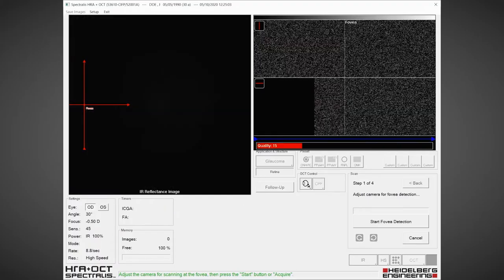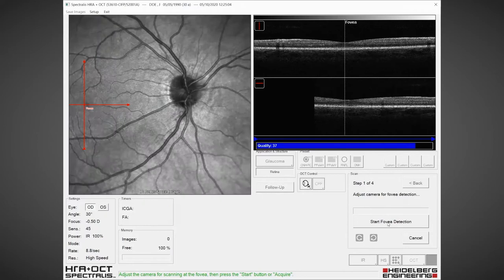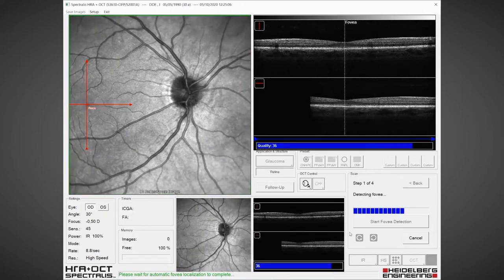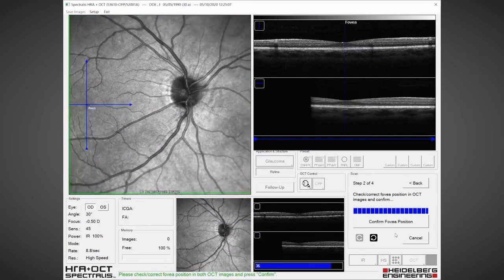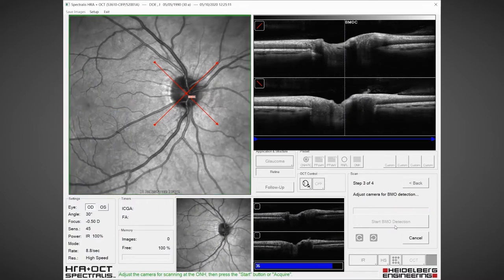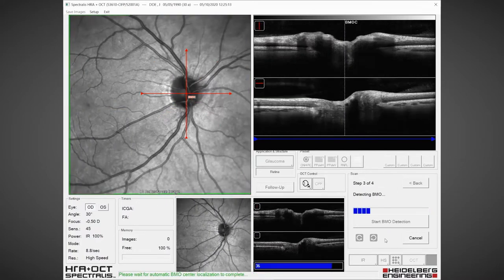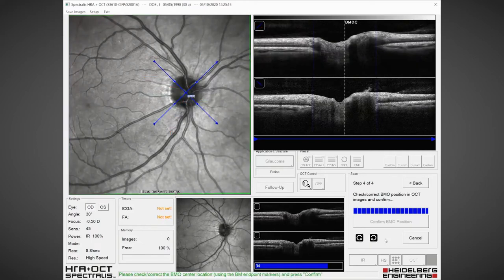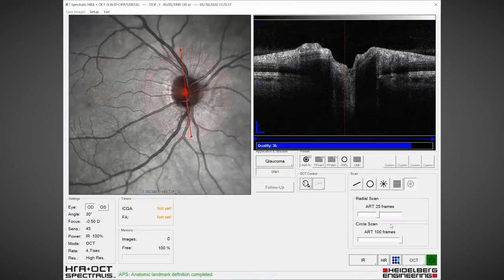We start fovea detection, wait for the blue bars to complete, and confirm that position. Then we move to the optic nerve, start BMO detection, wait for the blue bars to complete, and confirm BMO position.